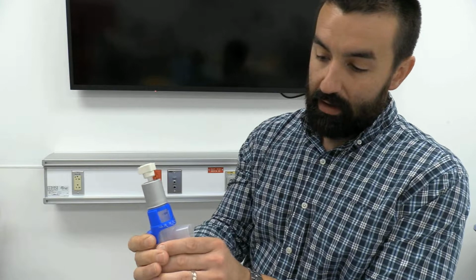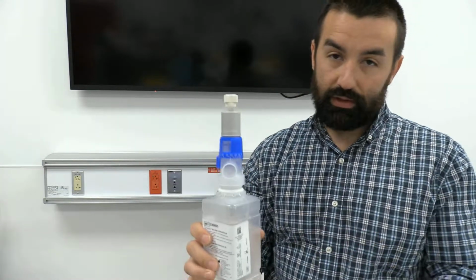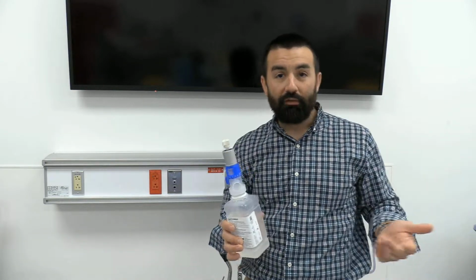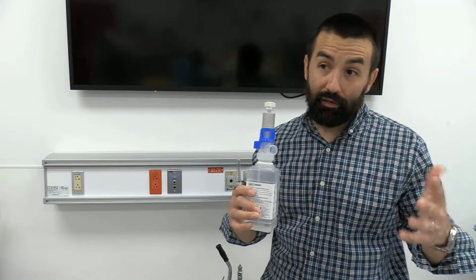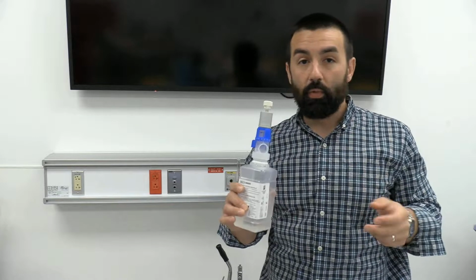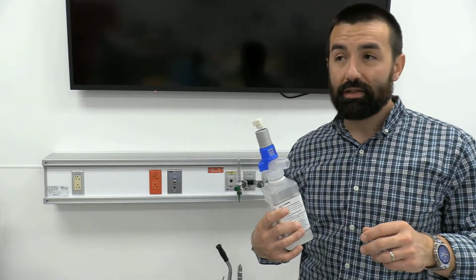You're going to pick your FiO2, so we'll go ahead and go. All the stuff you learned with air entrainment Venturis before, calculating the ratio and figuring out what you need to set your input flow at to make this truly high flow or get to our target of 60, all of that still holds true. It's just a different way of setting the FiO2 on this particular device.